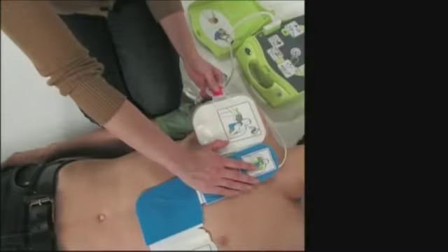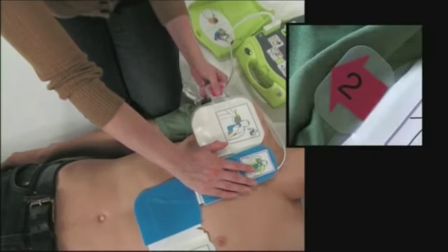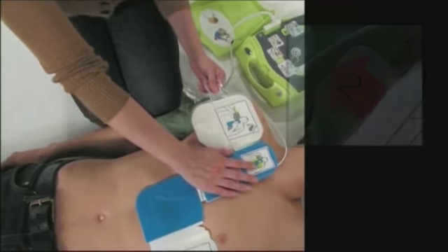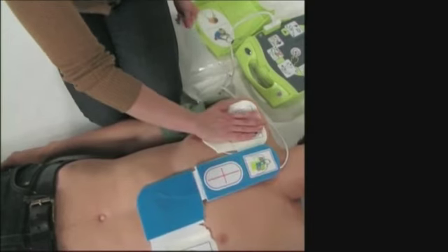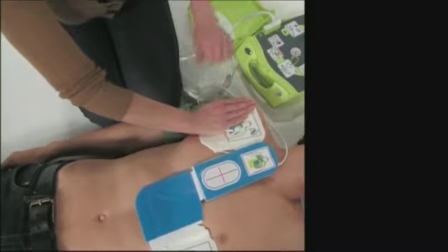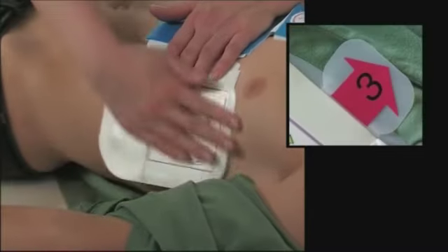Press the CPR landmark with your right hand and pull the number 2 tab to peel the protective backing from the electrode. Press the electrode from the centre out to make sure it adheres properly to the patient's skin. Repeat the action on the lower pad, marked with the number 3 tab.